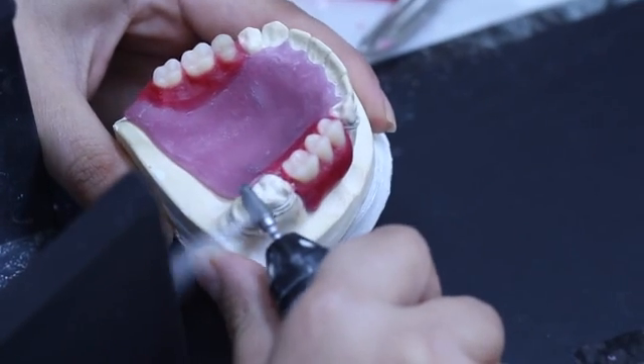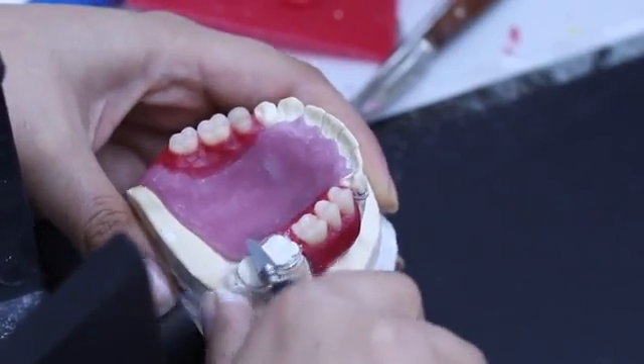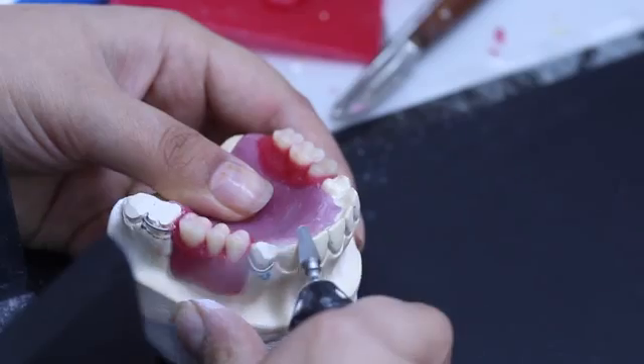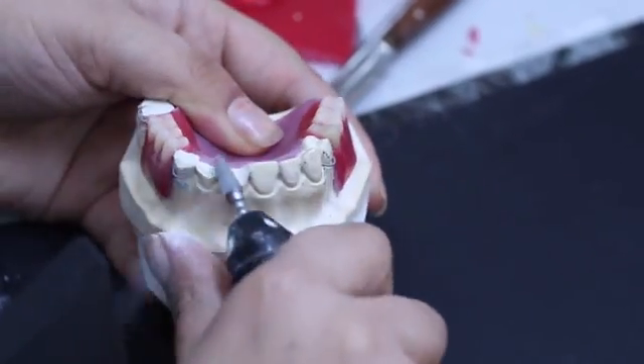Trim away stone teeth. This step is done to remove unnecessary undercuts and to facilitate subsequent procedures. However, a limitation of doing this step is that lab remount will not be possible, as all the occlusal surfaces of the teeth are gone and you are going to need to do occlusal adjustment clinically.